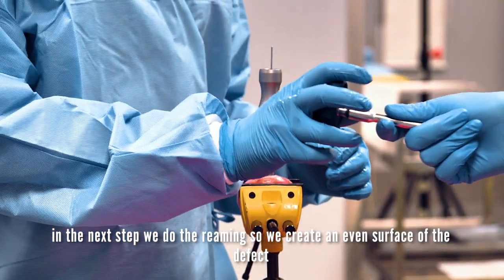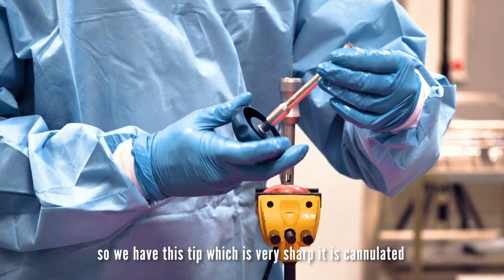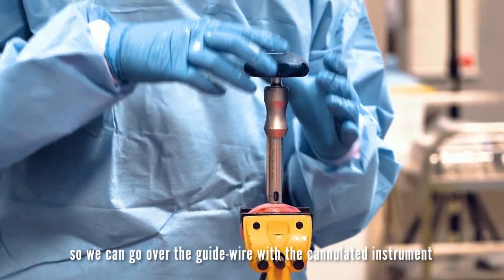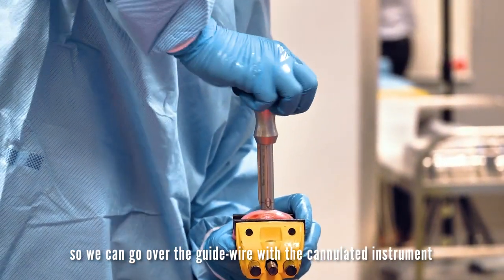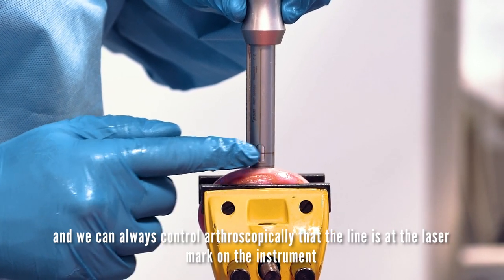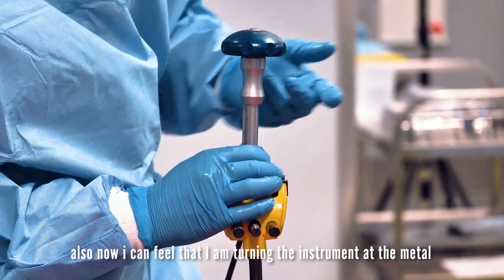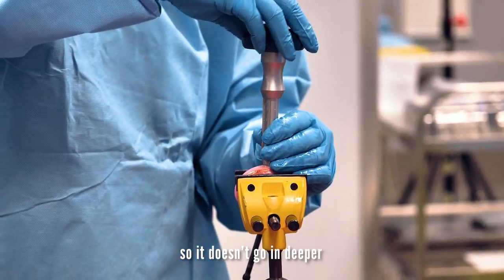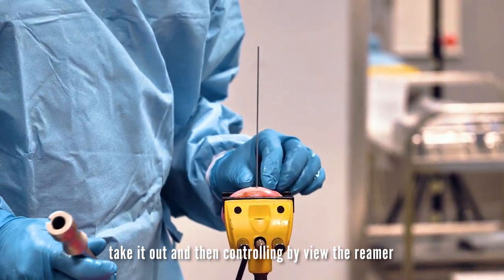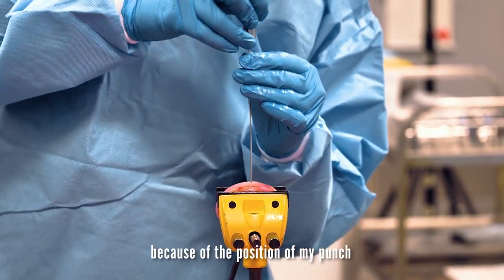In the next step, we do the reaming, so we create an even surface of the defect. We have this tip which is very sharp. It is cannulated so we can go over the guide wire with the cannulated instrument. We can always control arthroscopically that the laser mark line is on the instrument, and I can feel that I am turning the instrument at the metal, so it doesn't go in further. I take it out and confirm by view. In this case I would ream a little bit more by hand because of the position of my punch.